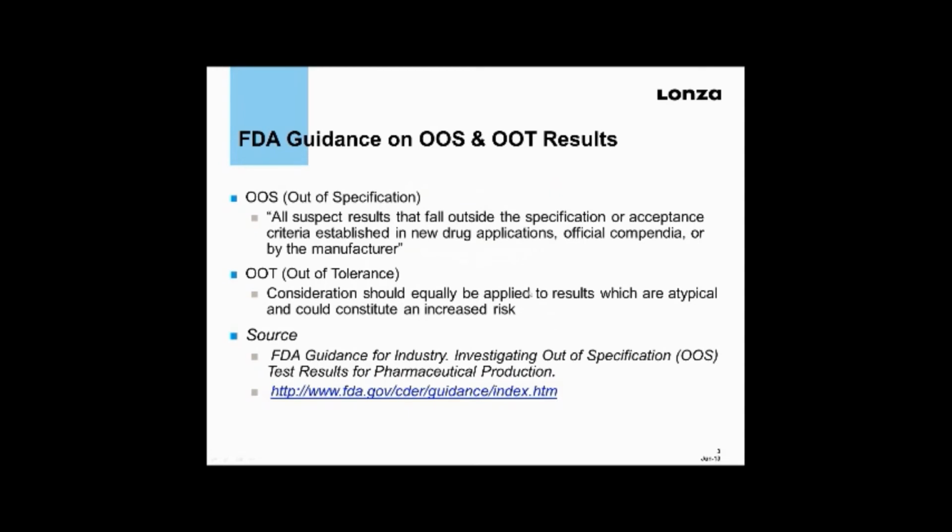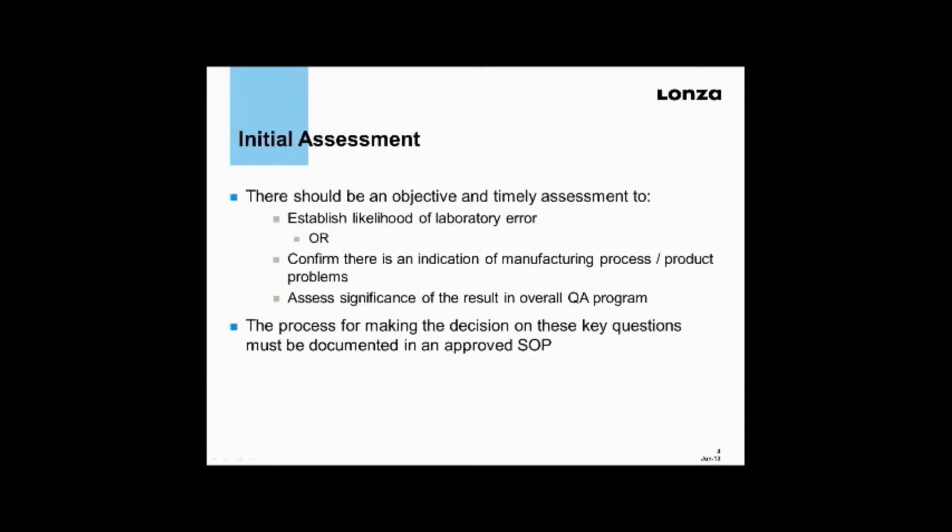and basically we need to establish whether or not there is a potential problem that can be attributed to laboratory or technical error, or if it's a genuine problem with endotoxin contamination at a greater level than we expect. In this latter case, it could be that the endotoxin level is simply higher than an internal action limit, or it's multiple instances of higher levels than a preset alert limit. In the worst case, of course, we are talking about a level that's actually higher than the endotoxin release limit, and potentially a product failure.